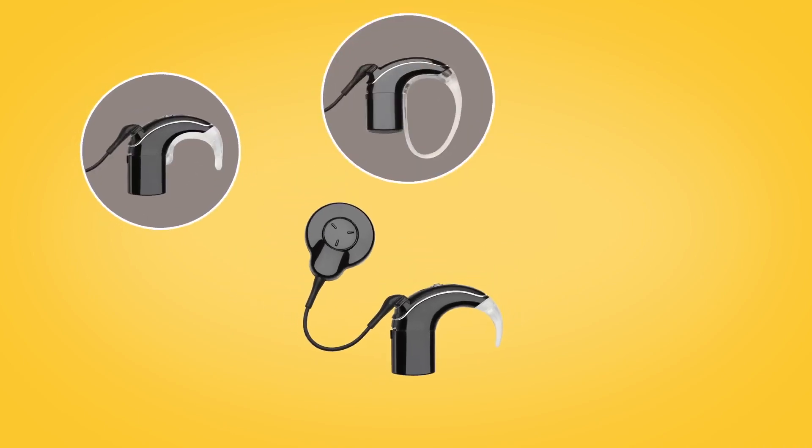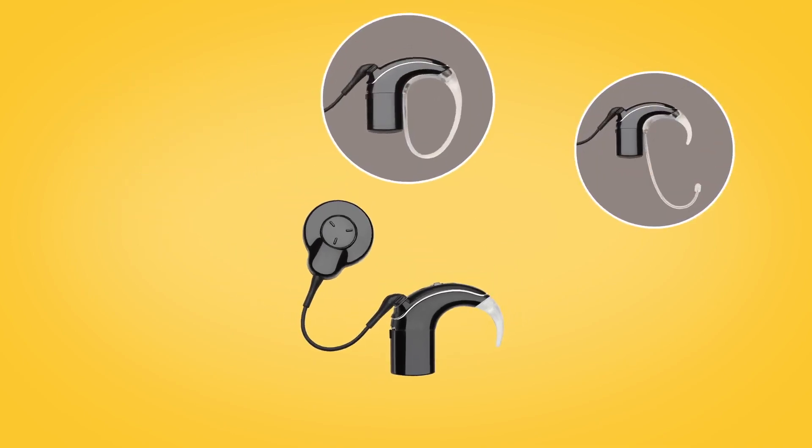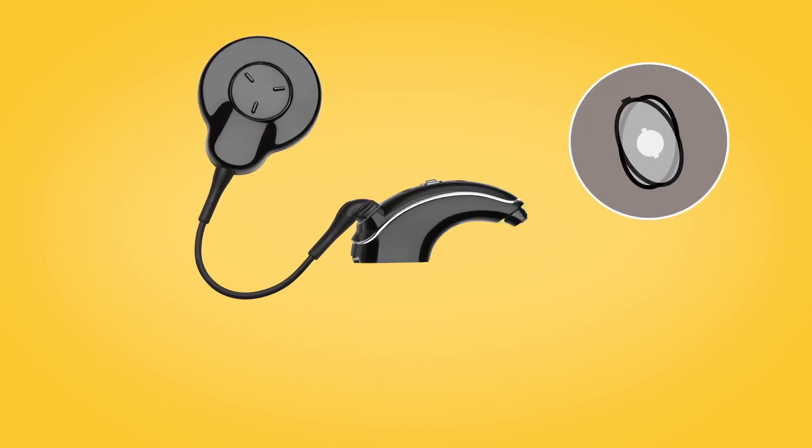To fit one of these retention options to the Nucleus 7 sound processor, first remove the earhook and battery module.